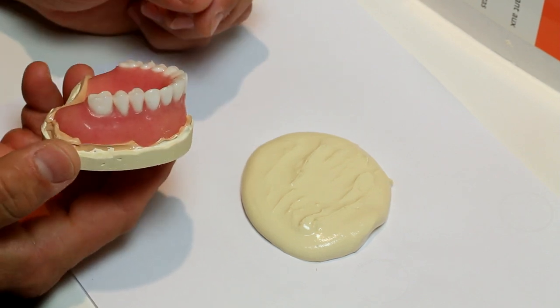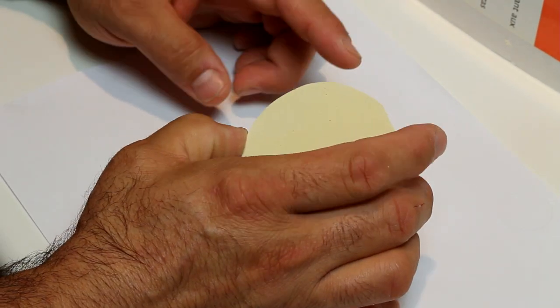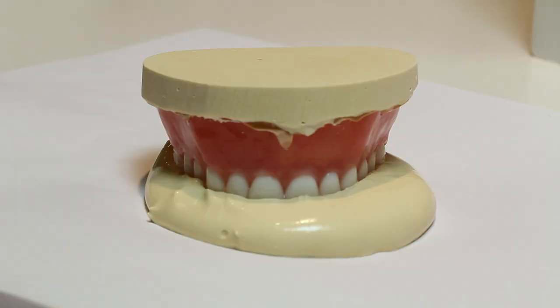Place the denture and model teeth down onto the stone patty, creating an index of the teeth. Let it set.